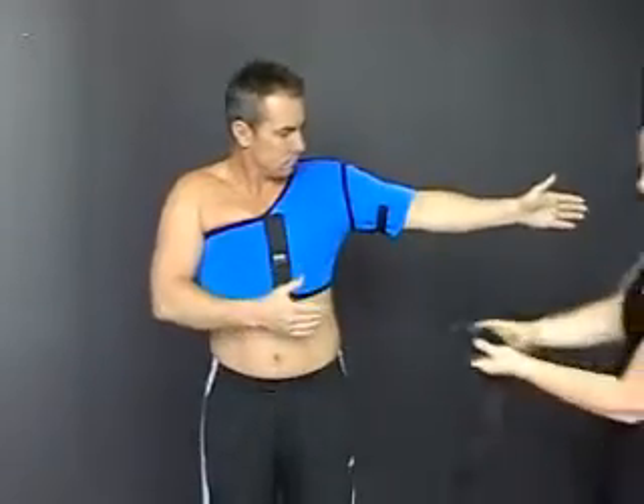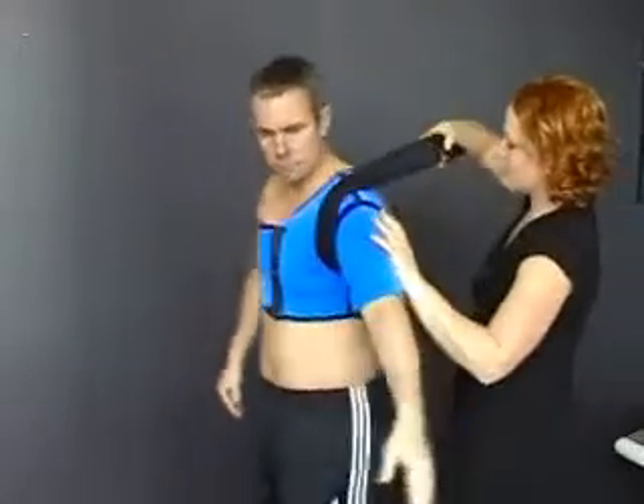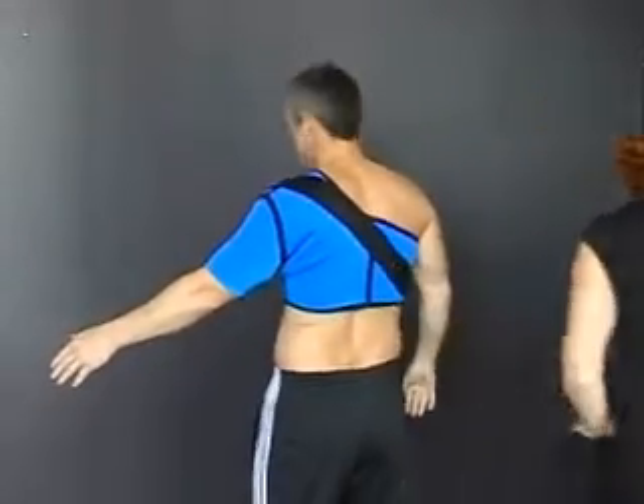Taking the short strap, attach the double velcro end under the armpit to sit across the front of the shoulder. Apply posterior pressure to the front of the shoulder and attach the strap at the back.